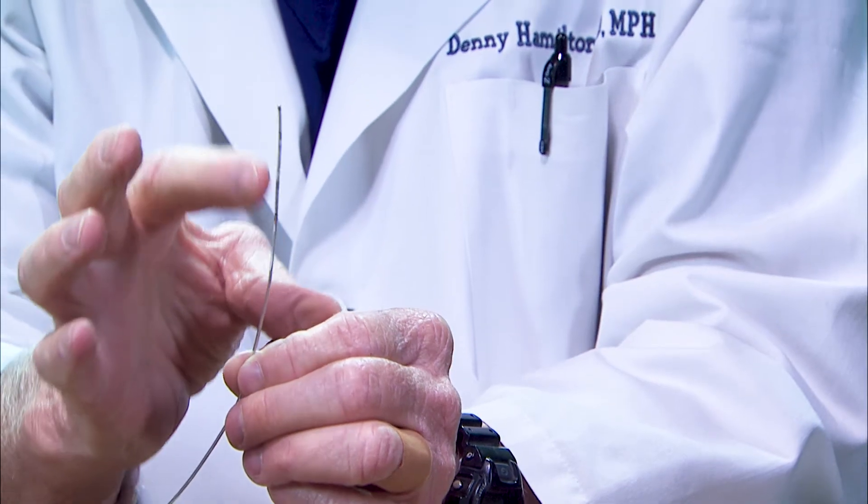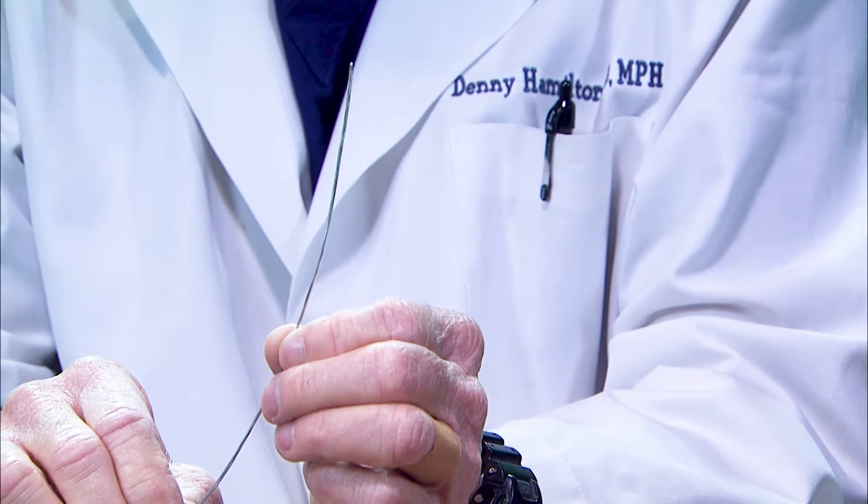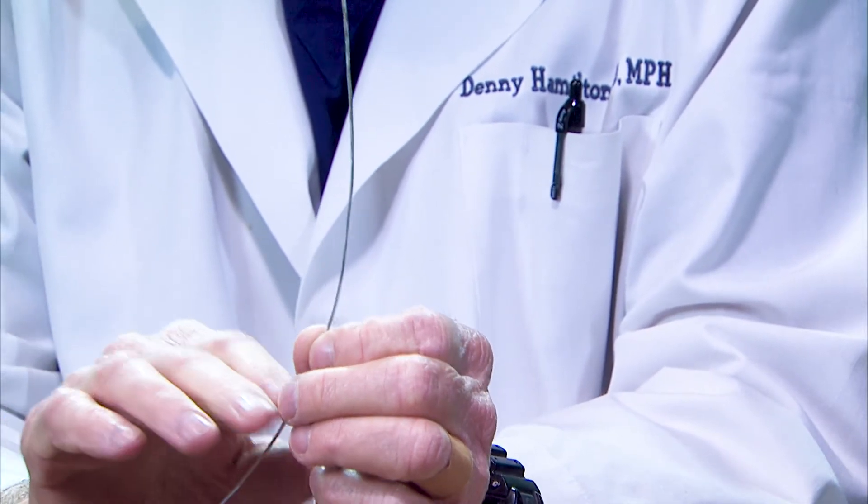At the end of the lead are electrodes. This lead goes along your spinal cord and comes out of your skin. The needles are taken out and the leads are left in. The leads are then attached to a generator that's taped to your back for five or more days. When you deliver an electrical impulse to the spinal cord, it helps block the pain coming up from your back or your legs.